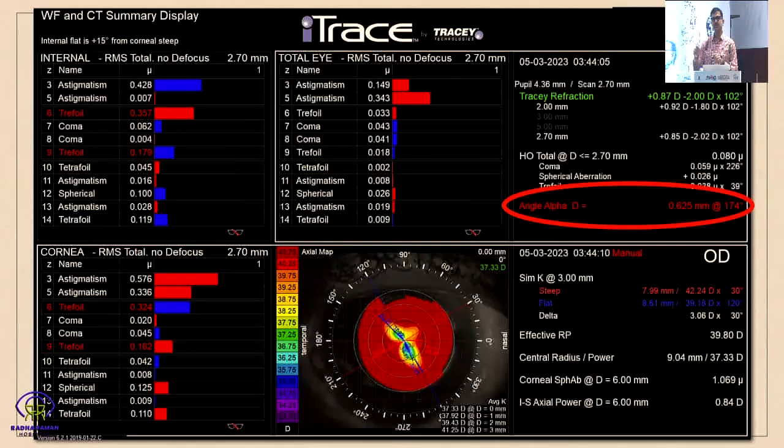Now, when you choose a particular trifocal and the angle alpha is a particular number, we divide the diameter of that central bullseye, and the angle alpha has to be within that. I'm a very, very strong believer of the angles playing a role in the adaptability of trifocal IOLs. I do not believe that they don't have a role. They do have a role, because I've seen people burning their fingers in that.